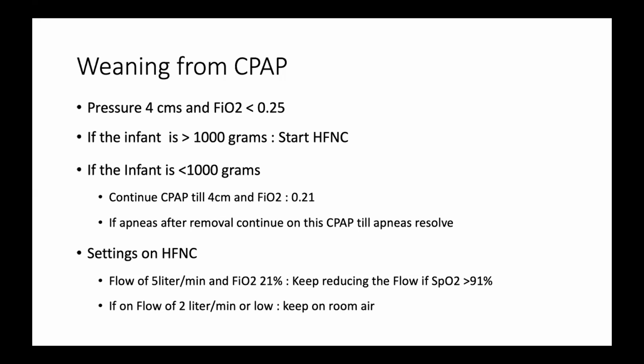And after removing the CPAP, if the baby has recurrent apneas, we continue to keep the baby on CPAP for another 24 to 48 hours. So sometimes you might have to keep extreme preterm babies on CPAP for weeks before you can take them off CPAP, but they may be very comfortable on a pressure of 4 and FiO2 of 21%.